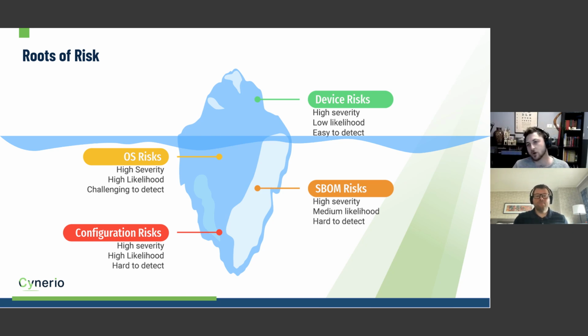Some sort of risk that is associated with a specific kind of device that does a specific function in the hospital, right? These are often pretty high profile. They're often quite severe, right? The impact is quite substantial. They shut down the device, or they can lead to a remote takeover of the device, or things like that. But in practice, these sort of vulnerabilities are quite rarely utilized, or maybe even close to never utilized by attackers when they're actually attacking a hospital or another healthcare organization.